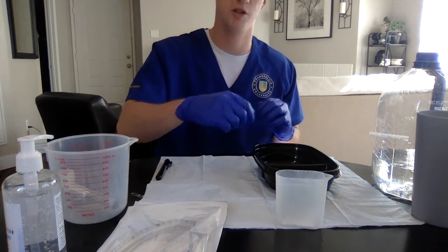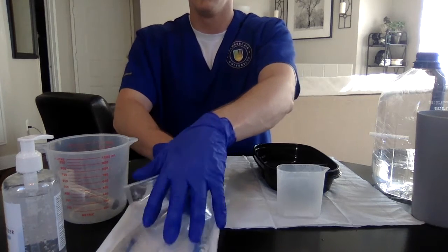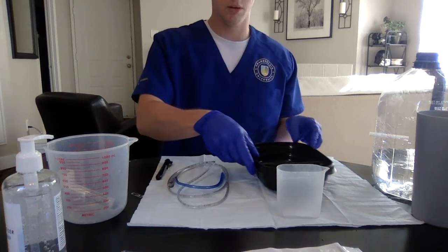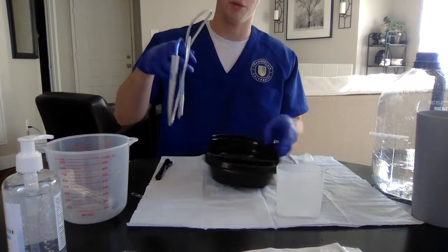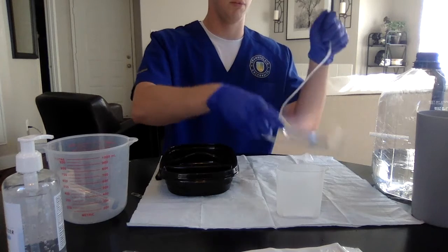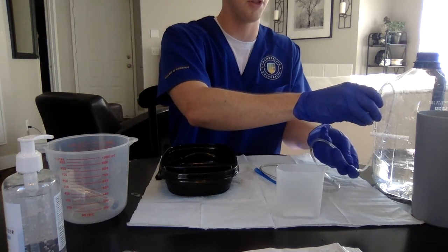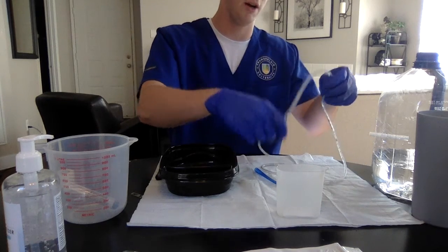We're going to have a drape for our patient to put over their chest. We have our pH paper here. Pull out our tubing here. Move this out of the way. So the first thing that we're going to do is measure how far we're going to be inserting this into our patient's nose. So we are going to start from the tip of their nose, and then we're going to go around their ear, and then down to their xiphoid process. And so for the sake of this patient, we're going to say it's 45.